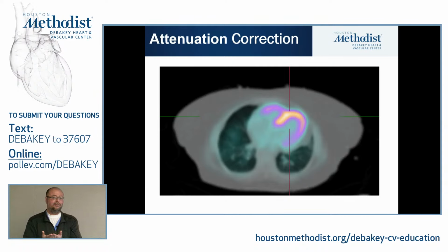If the patient moved in between, even though it's very quick, seconds, then the images may not fuse, and what you correct is really an artifactual one. When I was in fellowship, there was no remedy for that. The only way is to go back, beg the patient not to move, re-stress them, re-attempt it so that he doesn't move, and pray that that happens.